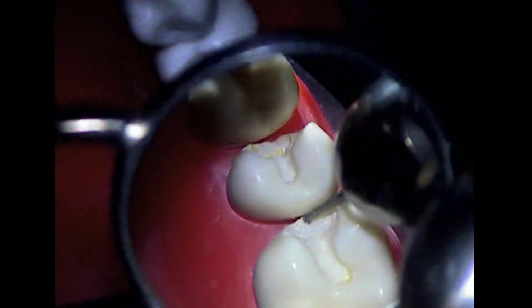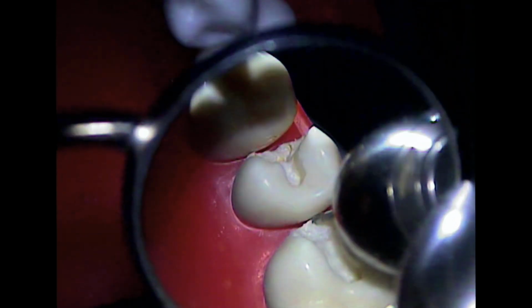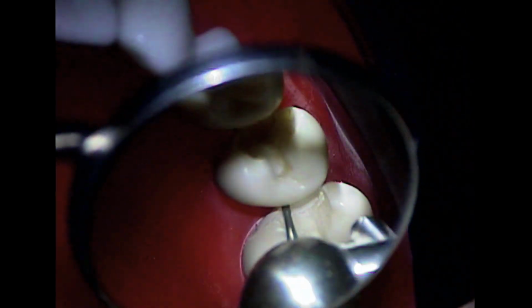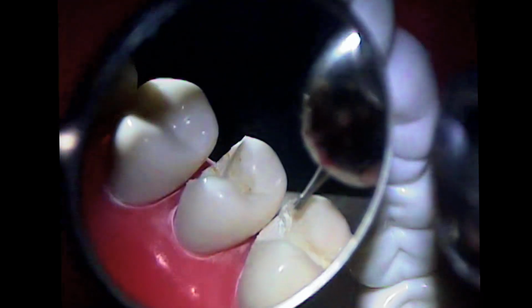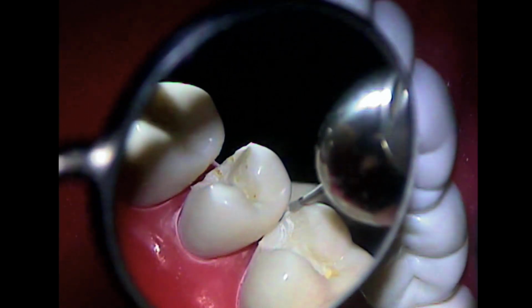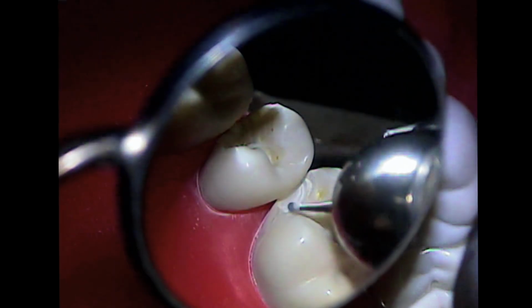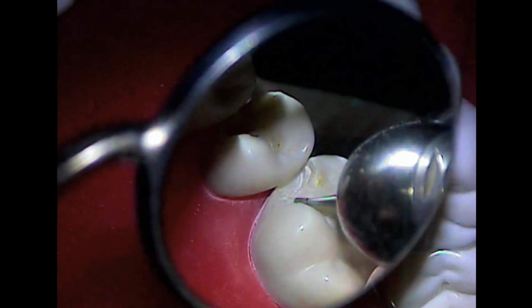This one you don't quite have the gingival clearance, do you? See that right there? It's only still 0.1. And you're leaning the burr lingually quite a bit over here, and this is still a little bit acute. So again, with the burr vertical, we always make sure we're happy with the occlusal outline first. Find your margin, find the angle, get the length, make the curve.